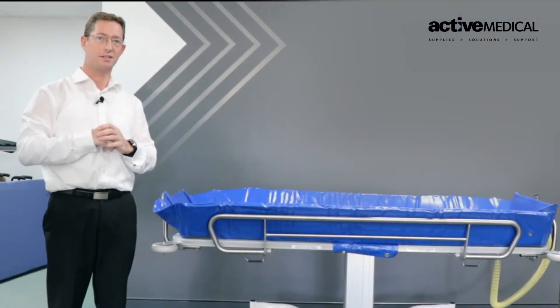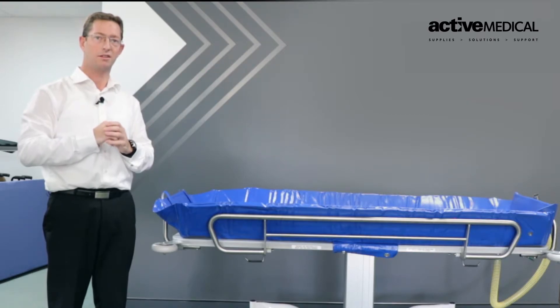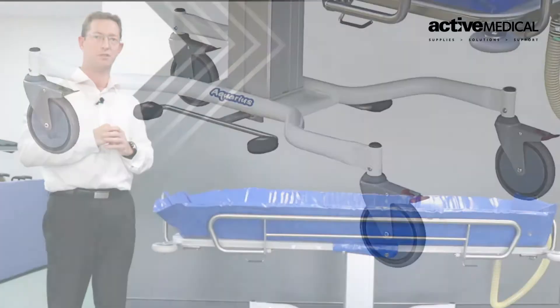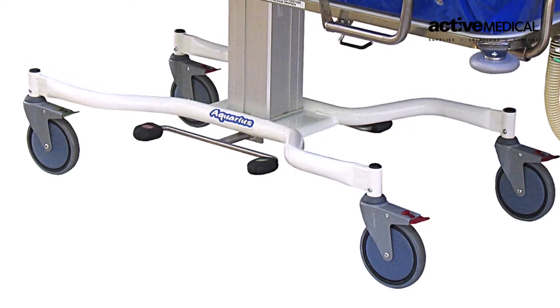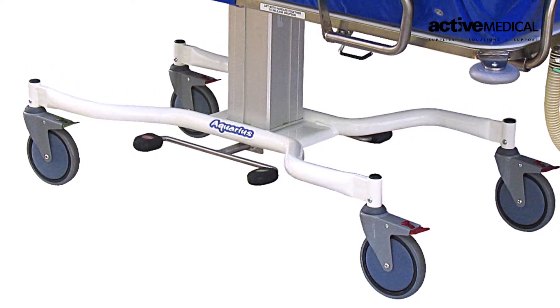Being a large caster, it gives us a lot of access underneath the shower trolley to ensure any lifters can pass underneath and safely place a resident or patient in the trolley during a hoist transfer.